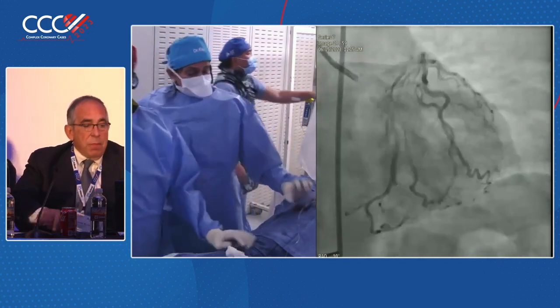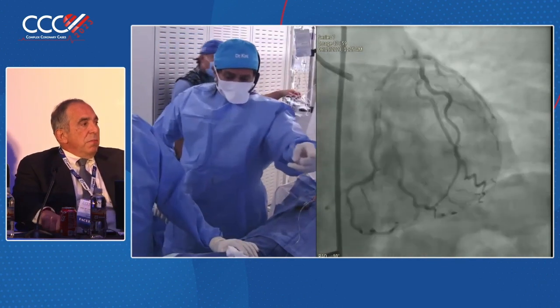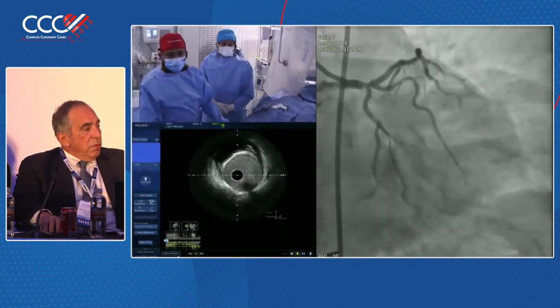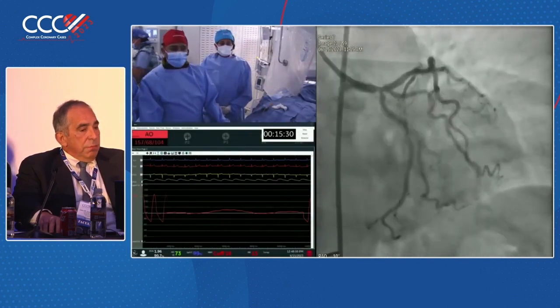Okay, well, let's go to Dr. Sutton. Yeah, I agree. At the ostium of the circumflex, it's a pretty short lesion. A provisional to me would be pretty reasonable in this situation. Yeah, I'd say the same, except I'm interested if on the IVUS there's not really that much disease in the ostial LAD.